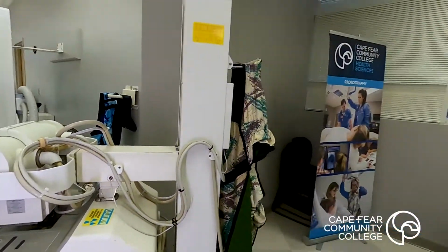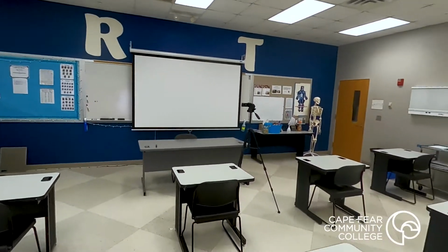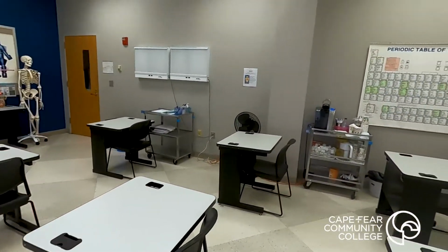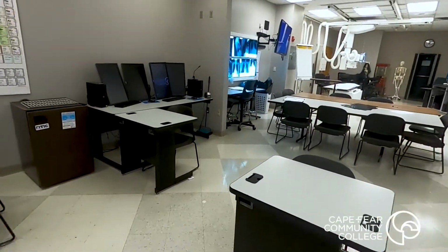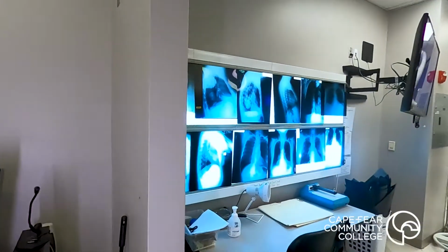As you can see, our lab is fairly small, so we have our students divided up into groups of 9 at most, supervised at all times by 1 or 2 faculty members. Thank you very much for attending this brief tour of the radiography laboratory. We hope that it has given you a better idea of what to expect during the lab portion of our curriculum.